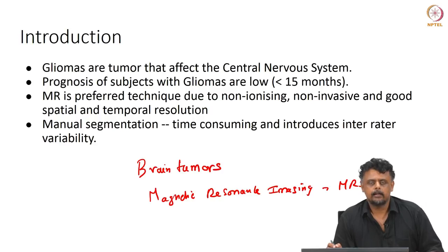And if you have a very large patient database, if you want to do a meta-analysis or anything, then manual delineation is exactly not possible. So, in order to augment a radiologist's effort, a deep learning program that can effectively segment the gliomas can be a very valuable tool.